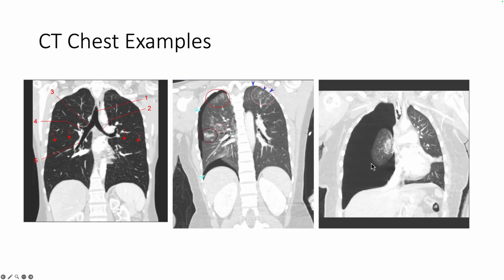What we see over here on this picture is the lung is completely collapsed. This is a 100% pneumothorax. We don't see any blood pooling in here. There's no little gray line down here at the bottom. This is just all black and all air.